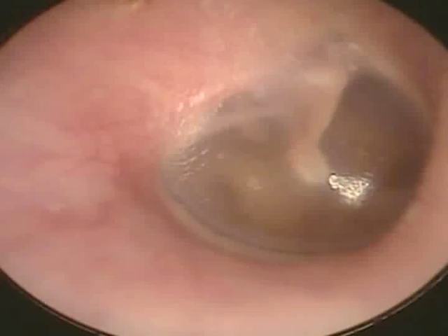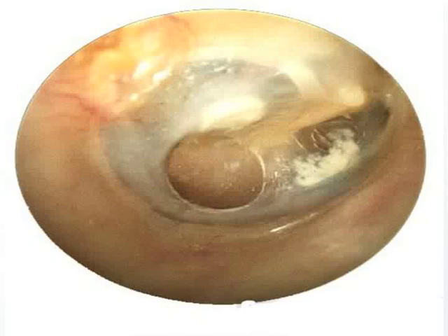So just remember that. We must also look on the tympanic membrane if it is intact. That means there must be no perforations or openings on the tympanic membrane. It must be intact. Okay. The other thing, the abnormal findings on the tympanic membrane: if you remember, the tympanic membrane must be concave in shape, concave.